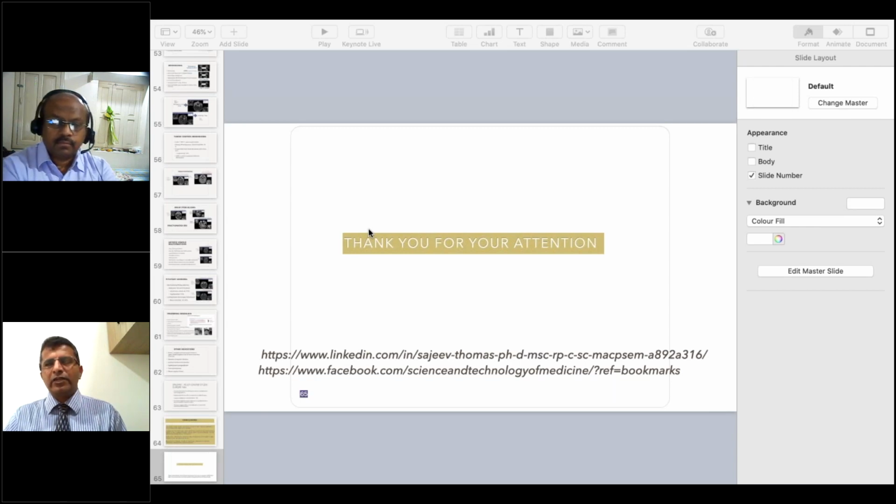Another reason may be that in CyberKnife there are concepts called nodes. When you design a treatment, they use nodes, which are specifically defined points. Those points will be positioned for the exposures by the CyberKnife system, which uses a single source.